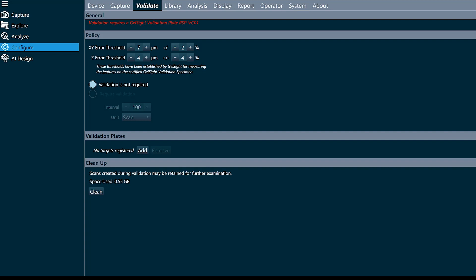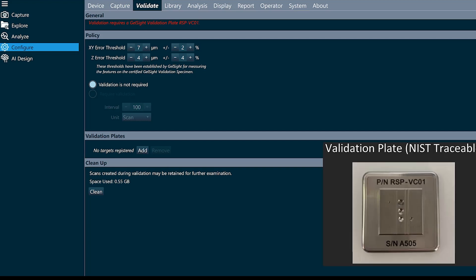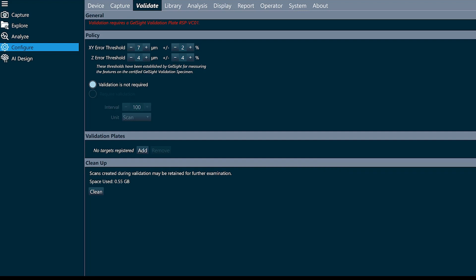This requires an extra plate. The first thing that we'll do is upload the XML file that corresponds with my validation target. I can see on my target that my serial number is A556, so I'm going to upload the XML file for A556.